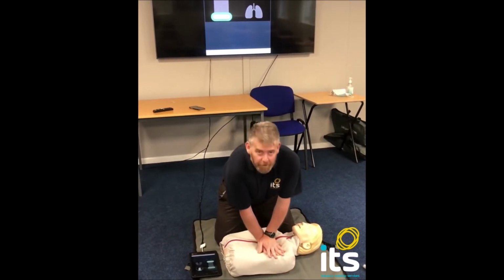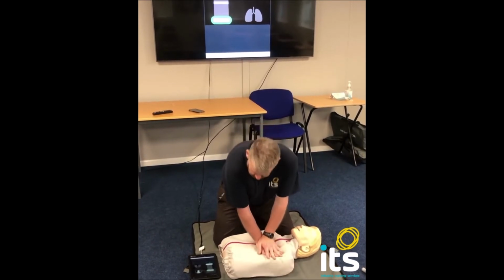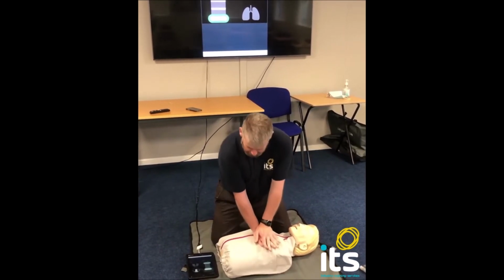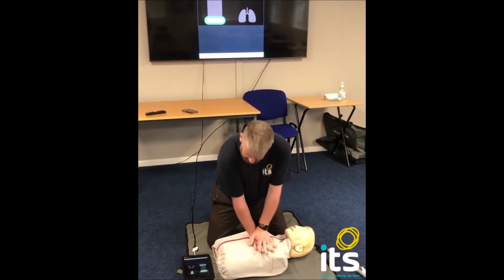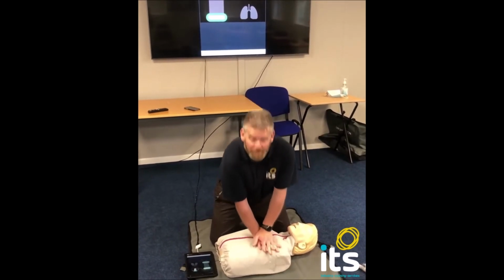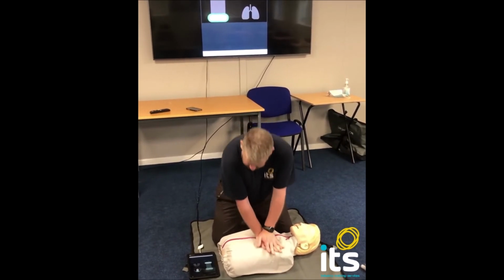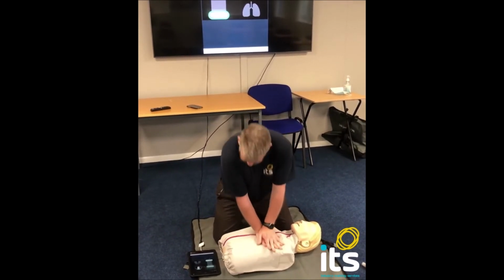If you don't go down far enough and come up high enough and stick to the right rhythm whilst you're doing CPR, you will not fill enough blood into the heart and the cardiac arrest will continue. So it's important to make sure you get yourself in the right position so you get a good even distribution of your weight on top of the person's chest, so you can effectively pump the heart as if it was manually doing it itself. What this technology does is it shows you the effectiveness of your compression, and as long as you're above 70%, you're giving the person the best chance you can.